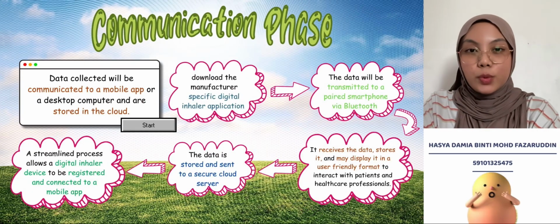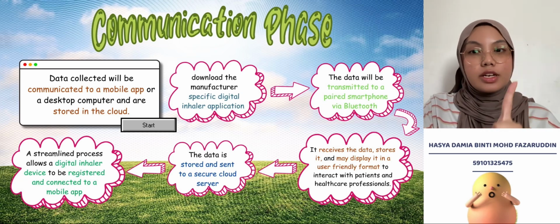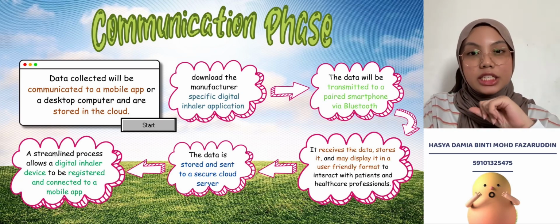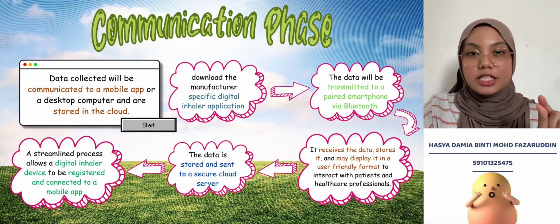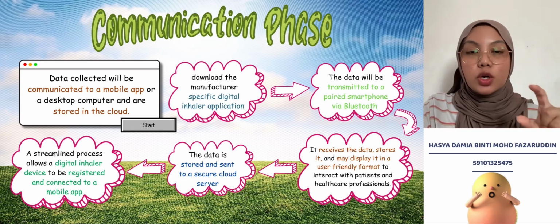Hi, Assalamualaikum. My name is Hasha and I will continue with the communication phase. First, the data collected from the digital inhaler will be communicated to a mobile app or desktop computer, and the information will be stored in the cloud.